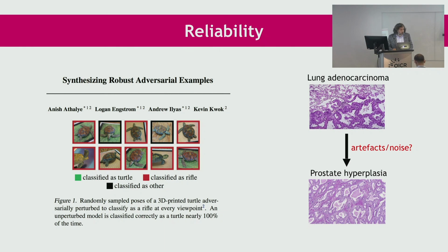People are looking into it. This is a serious concern. Again, direct adversarial attacks are not possible in medical imaging, but some other stuff is, of which we have many. We have artifacts left and right in the lab when we work with the specimen.